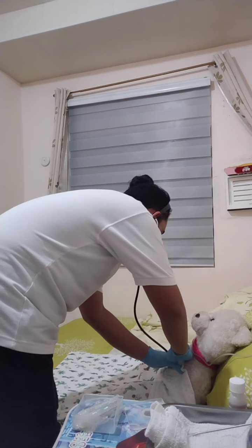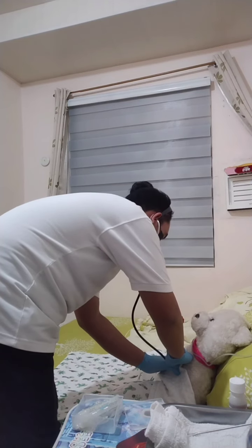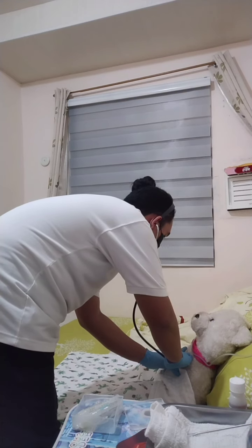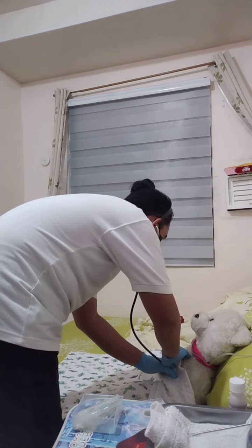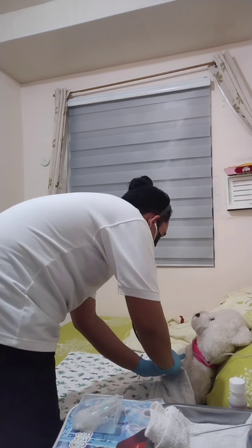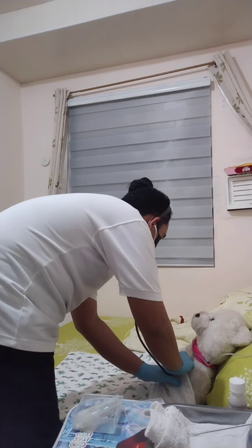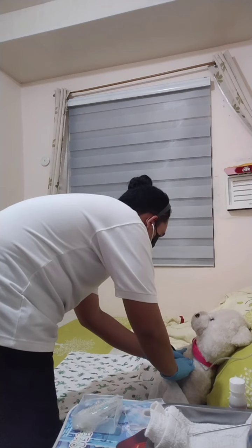Measure the pH of aspirated GI contents. Fasting gastric pH is usually equal to or less than 4. It is only infrequently greater than 6. In contrast, intestinal aspirates usually have a pH equal to or greater than 7. Observe the aspirate's appearance. Gastric fluid is usually cloudy and grassy green, or tan off-white in color. In contrast, intestinal fluid is usually deep golden yellow and is clearer than gastric contents.